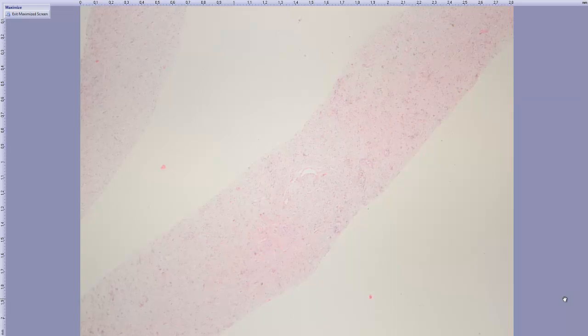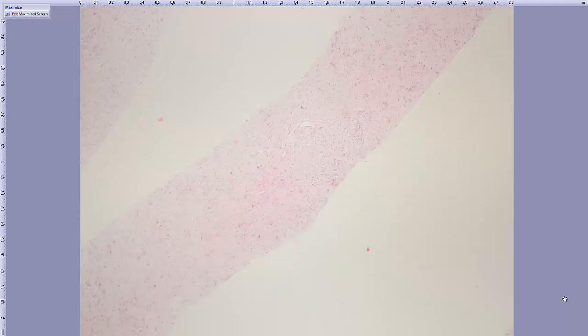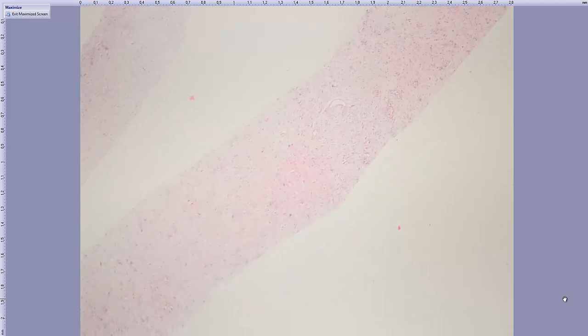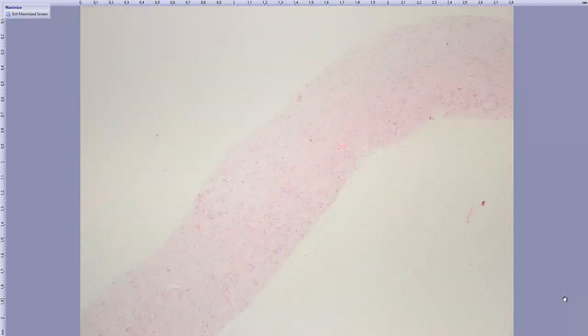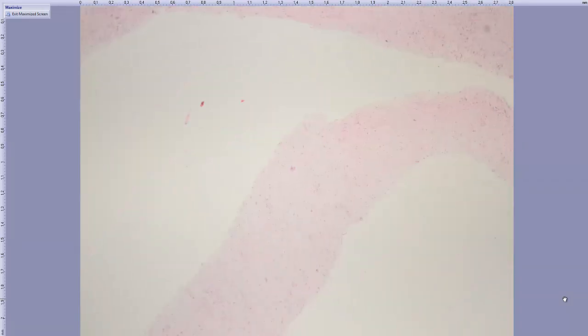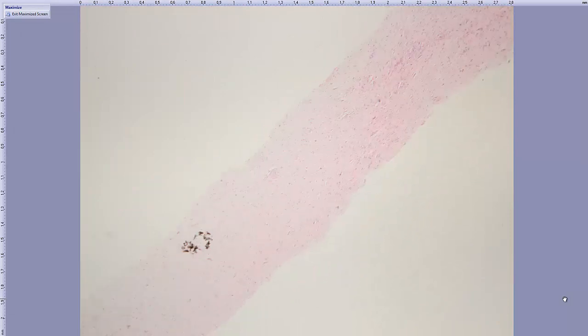This is a core biopsy from a 50-year-old male. At low power we have three core biopsies.